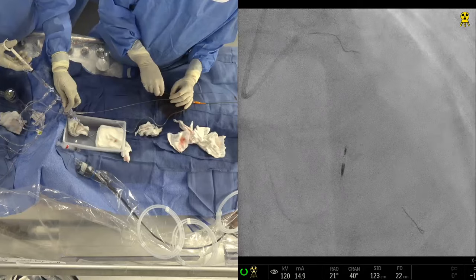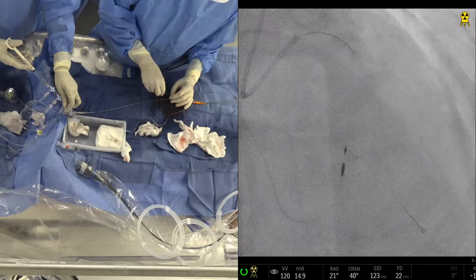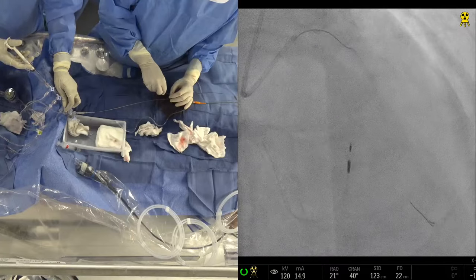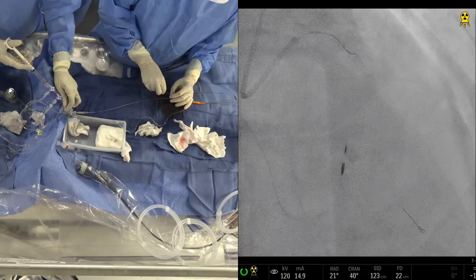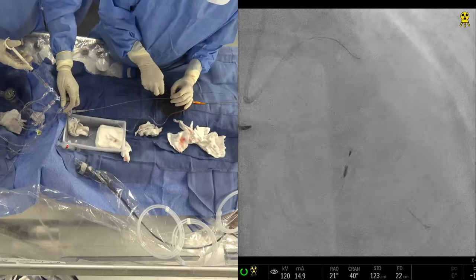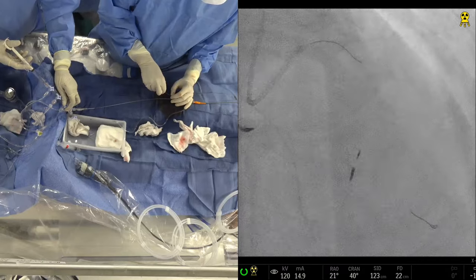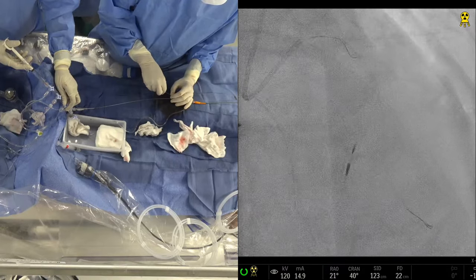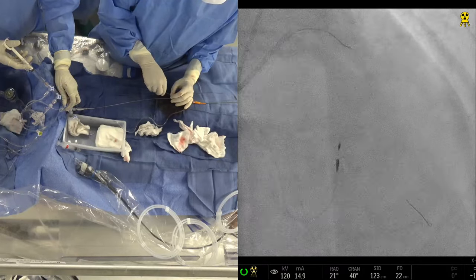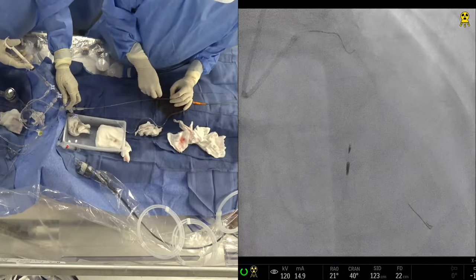We say you cross where your optimal cell is, not proximal or distal. So the whole question comes to proximal versus distal. Some data have shown that if you go proximal in the mini crush, you deform the ostium. But to me, I think you just go with the middle. You'll be happy if you are able to cross and finish in time. I don't think we need to get too crazy about which cell you went through.